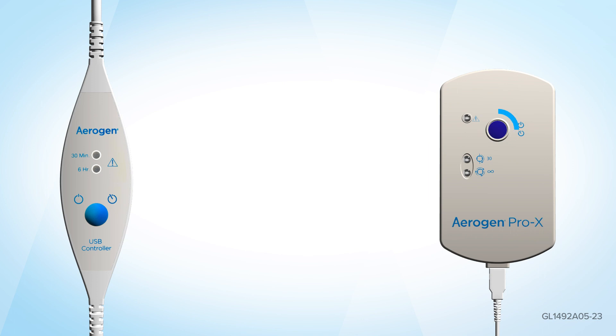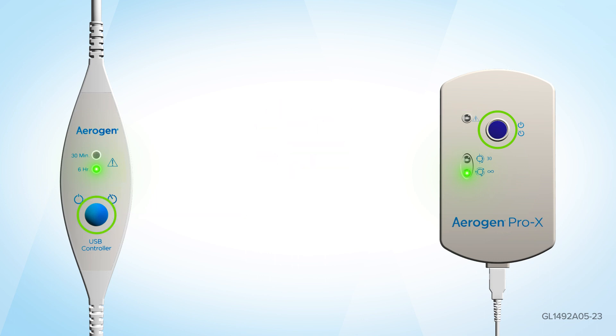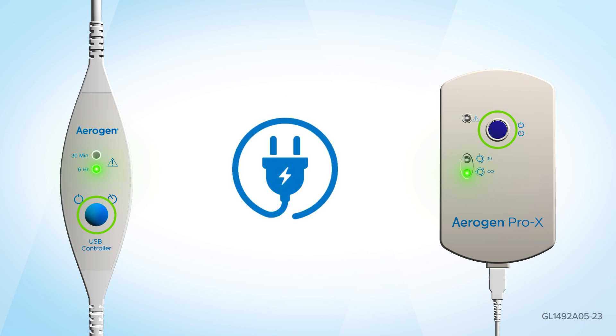When using the Aerogen continuous nebulizer tube set, press and hold the on-off button for 3 seconds from the off position to operate the Aerogen Pro-X controller in continuous mode or the Aerogen USB controller in 6-hour mode. Please note, to use the Aerogen Pro-X controller in continuous mode, you will need to be attached to the mains power supply.